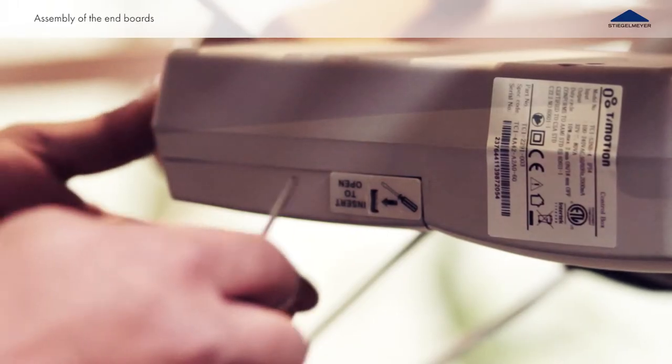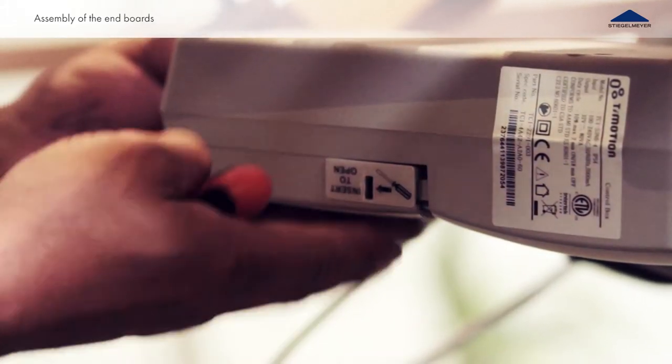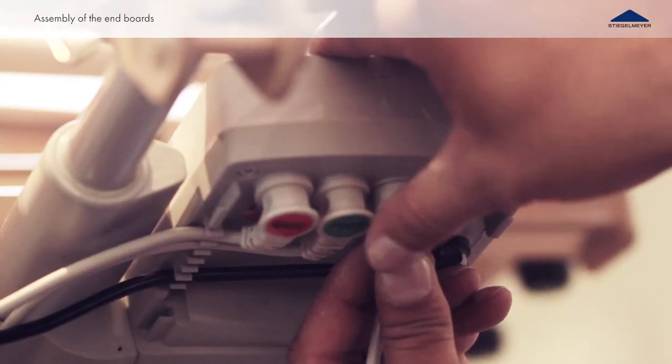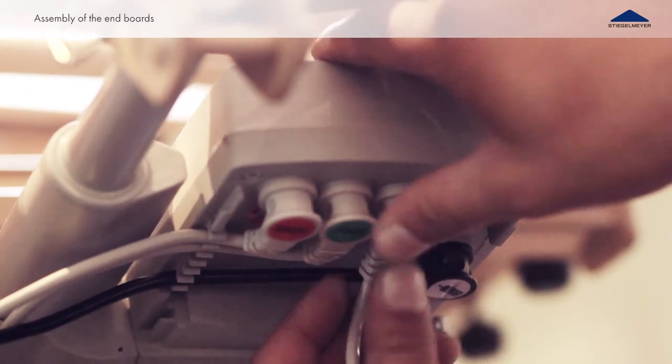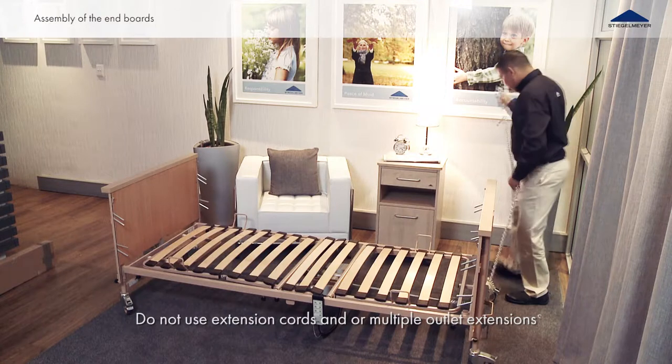Connect the high-low actuator cables from both the head and foot sides to the control box located underneath the lying surface. Connect the bed directly to a wall outlet.